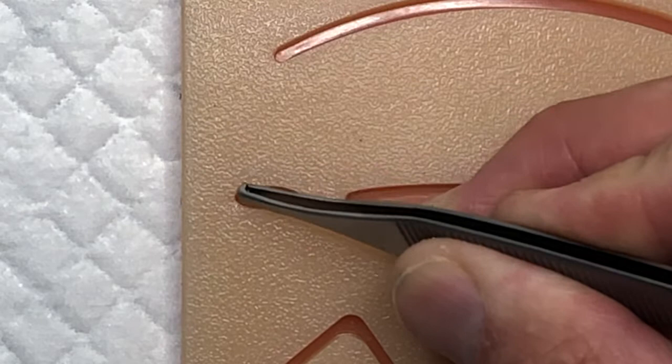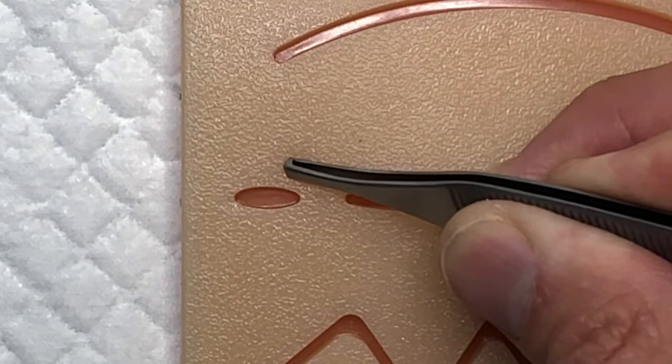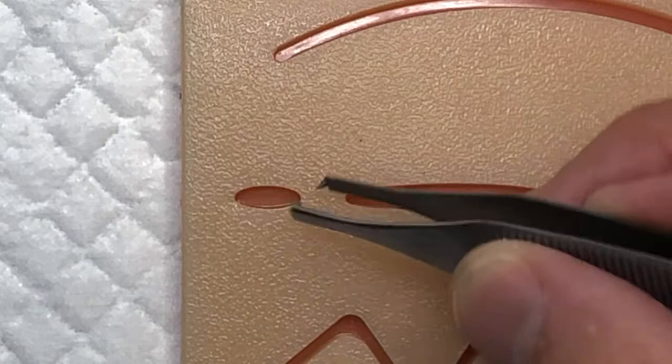You need to be able to tamponade that bleeding and shut it down to get the patient on their way. A figure-of-eight stitch — the name implies it's a figure of eight, so it looks like the number eight. Essentially, you're taking your suture, putting it in here, coming out here, going across, then reintroducing the needle back through, and then you tie it off. We'll see it in a second — it actually looks like an eight.